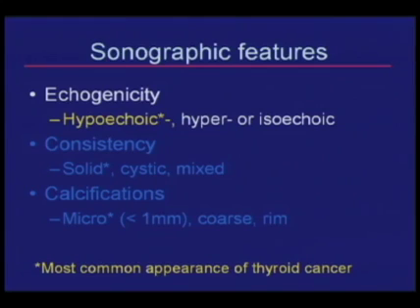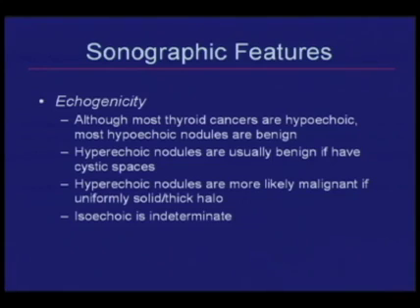In terms of the sonographic features, let's review some of these and see if they help us to determine which nodules would be more likely to represent a malignancy. In terms of echogenicity, hypoechoic is a feature that we look for. The problem, however, is that although most cancers are hypoechoic, most hypoechoic nodules turn out to be benign because benign nodules far outnumber malignant nodules.